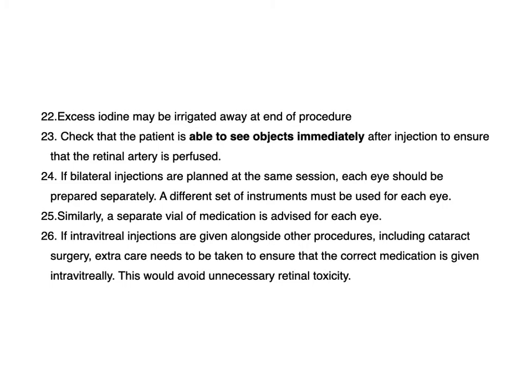For bilateral injections ever to be done, the whole procedure is repeated with a complete new set of instruments and different batches of the drug to be used.